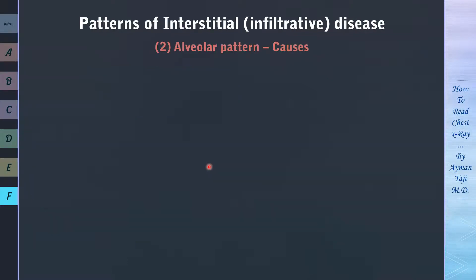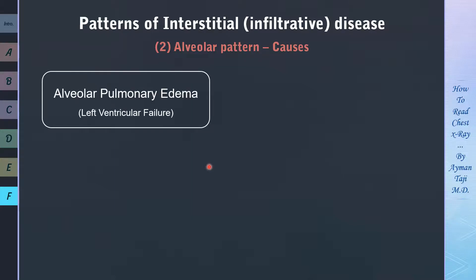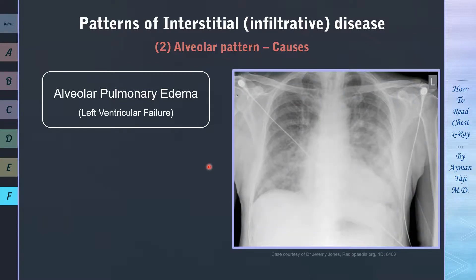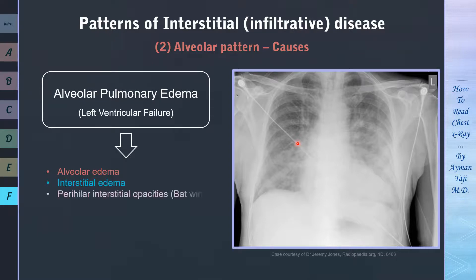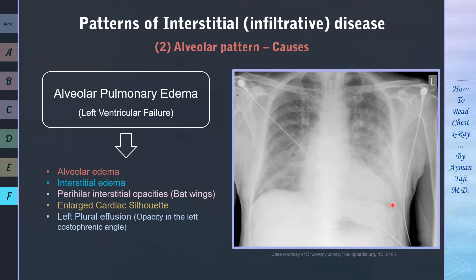If you remember from the previous lecture, when the left ventricle is unable to pump sufficiently, fluid starts to accumulate abnormally in the extravascular compartments of the lung — first in the interstitium, causing interstitial pulmonary edema. Then if fluid continues to accumulate, interstitial edema becomes alveolar edema and we see fluffy, cloud-like and hazy opacities. In this case, we see both cloud-like and reticular opacities, indicating both alveolar and interstitial edema features, along with perihilar opacities or bat wings, an enlarged cardiac silhouette, and left pleural effusion visible as an opacity in the left costophrenic angle.